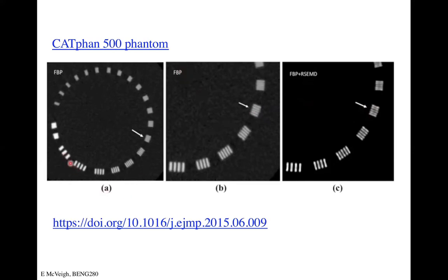In general, you look around this curve and see, okay, I can't really determine anything anymore. There's my cutoff frequency. So you just directly measure the modulation transfer function. And then these intermediate points here will give you those intermediate points between 1 at the origin down to 0 at the highest spatial frequency.